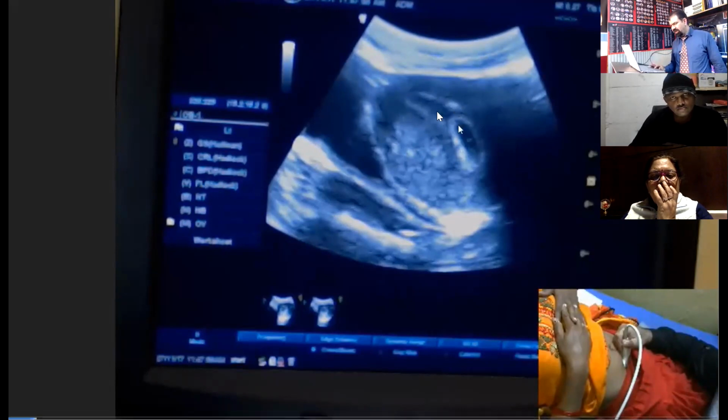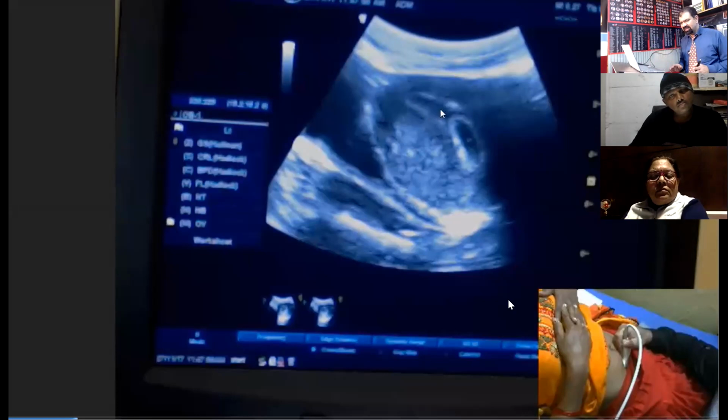Because this unobliterated uterine cavity is telling me that, doctor, you are not dealing with an ectopic pregnancy or a pseudo-gestational sac. This is a true intrauterine gestational sac. So this is the importance of the unobliterated uterine cavity. Yes, sir. Here come the decidua parietalis and decidua capsularis, which were already discussed in great detail with you. So this is the unobliterated uterine cavity.